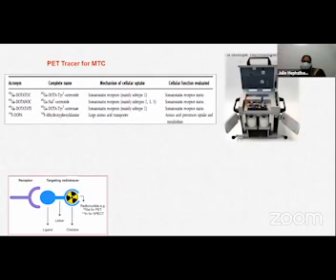Germanium has a half-life of about 271 days, so it can be used in a department for close to a year. The daughter product of germanium is gallium, and these are tagged with DOTA peptides. As you can see, it's a chelator, a linker and a ligand. The most commonly used are DOTATOC, NOC and TATE, and in our institute, we use DOTATATE.